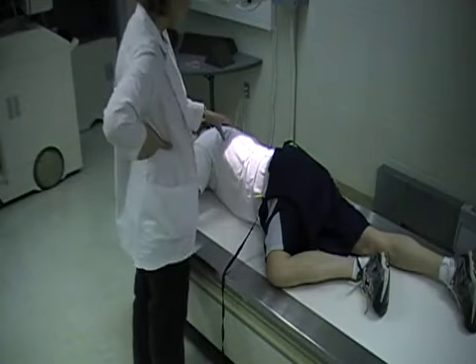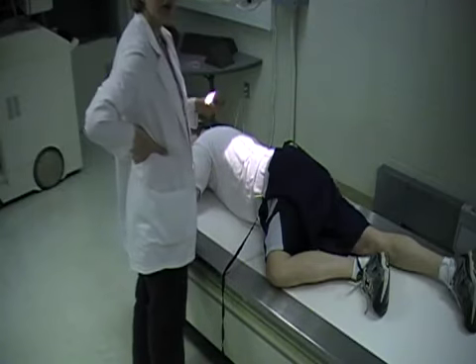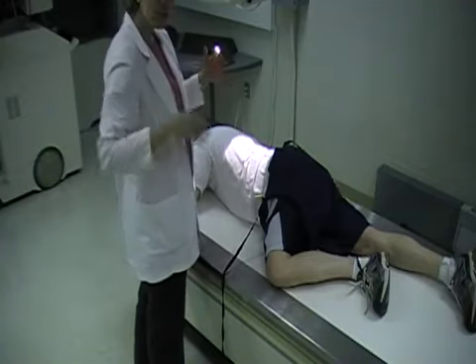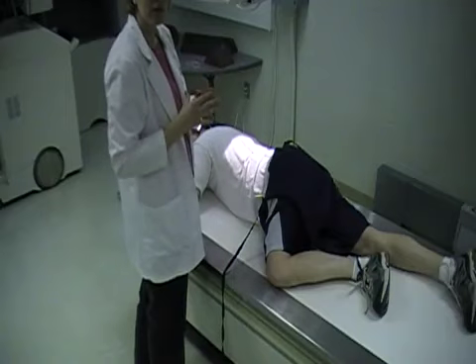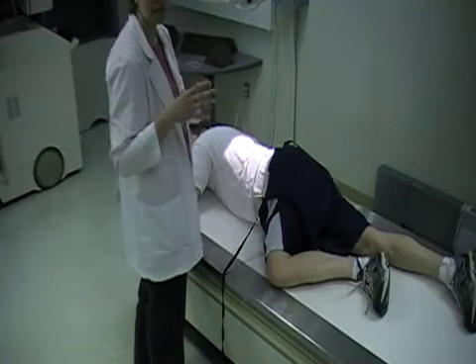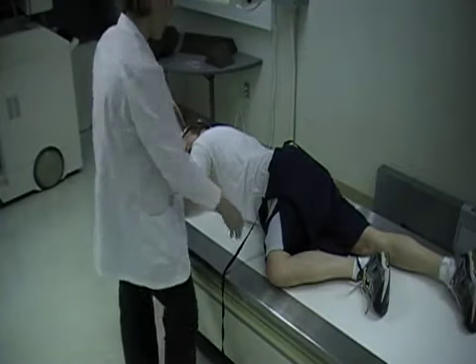And the RAO, this is the image where you're going to see the duodenal bulb fill with barium best. With the RAO, right lateral, you see the barium empty out real well, and you're going to see the bulb full of barium as it's starting to traverse into the small intestine.